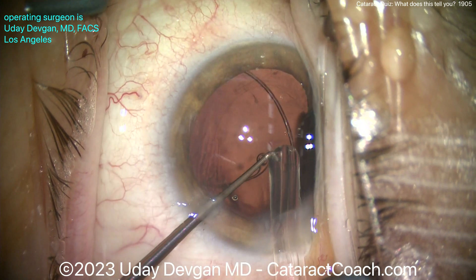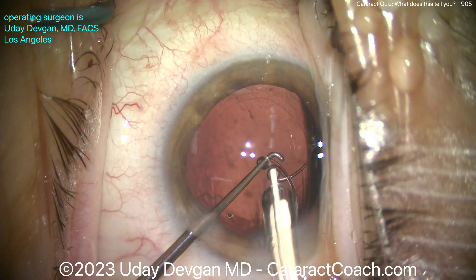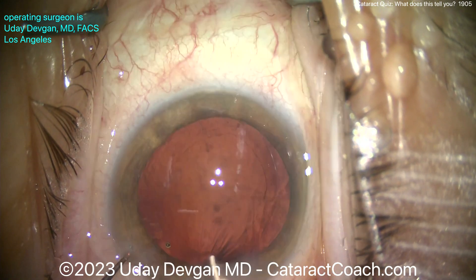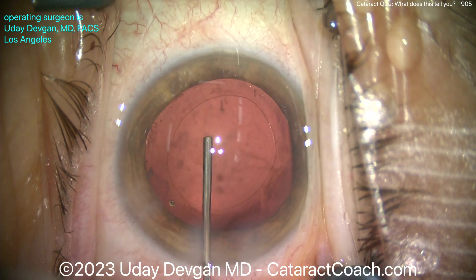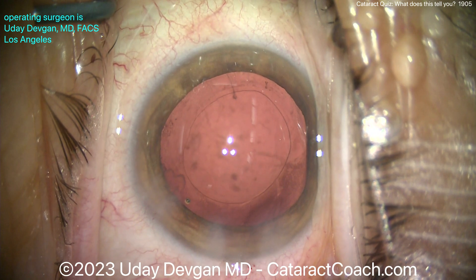Look — it's not touching the bag until now, and that's very gentle. At the end here we can let go of both, push it off the tip of the hook, and take it off the injector as well. There it is, completely in the capsular bag. Now you've got a sufficient degree of support. Put a little more viscoelastic — let's get that IOL in the capsular bag.